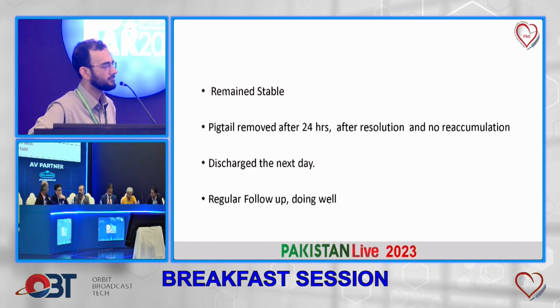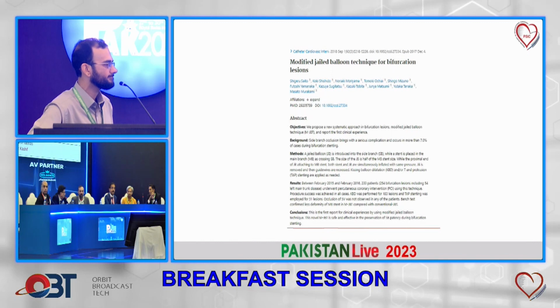I think it all depends on personal choice. Well, I think clopidogrel will probably be a better choice, because we have to prevent ISR, not stent thrombosis. So in my opinion, there would not be any difference. Like in the first case of Dr. Jabbar, after about 2 months it was fully occluded. At 1.5 months, there was stent thrombosis inside this covered stent.